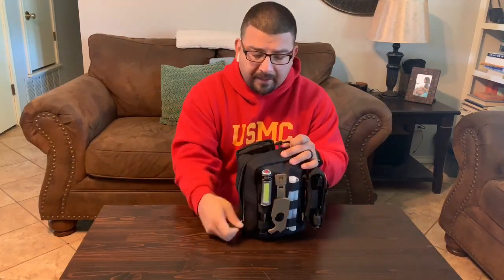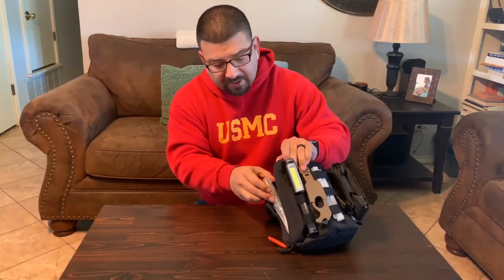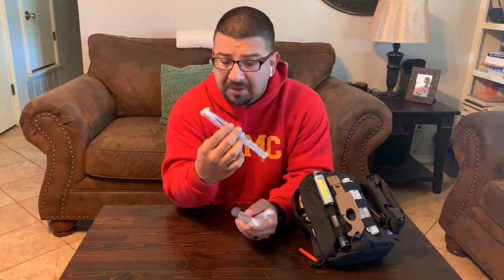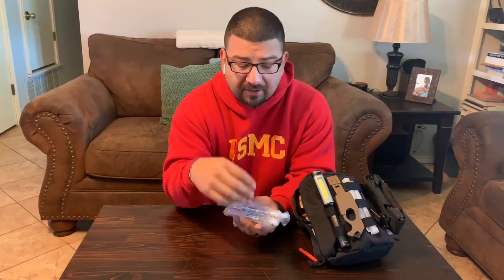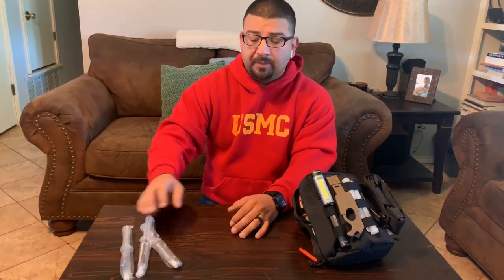On the inside of the bag, again, I'm not going to pull everything all the way out. Right here on the side, I have these little saline squirters. I don't know exactly what they're called. But if somebody's been in an accident, they're rolled in the dirt, something like that, smaller stuff, cuts, stabs, I can use this to clean them out, to try to keep as much of that bacteria out as possible before we bandage them up so it doesn't get infected.